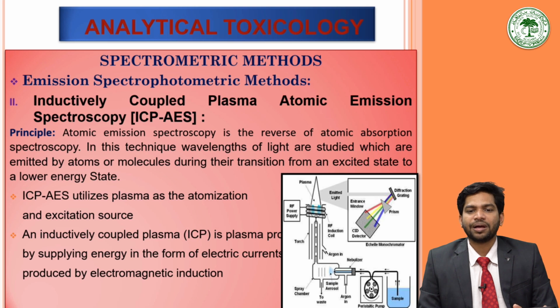Inductively coupled plasma atomic emission spectroscopy utilizes plasma as the atomization and excitation source. Plasma is a state of matter similar to gas in which particles are ionized.